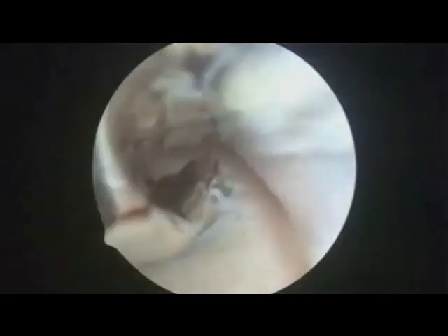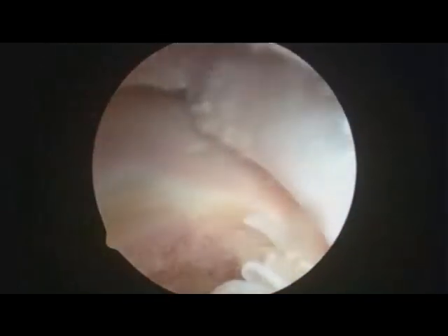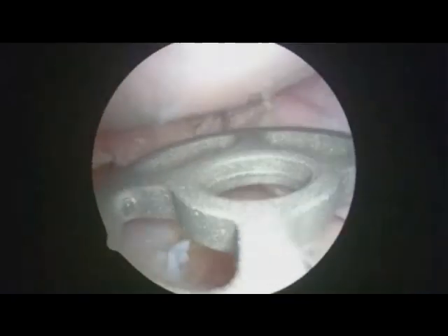And for this purpose, you see that we have a tibial defect just off the eminence there in the anteromedial tibia, in the weight-bearing portion of the tibia. So our first step is actually centering our insertion device over top. So this is where our tibial implant is going to sit.